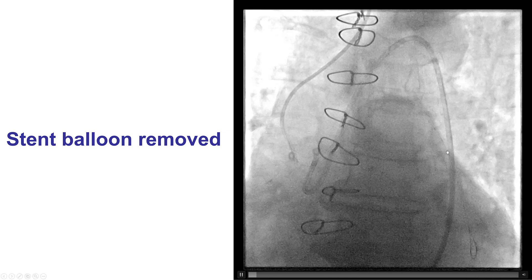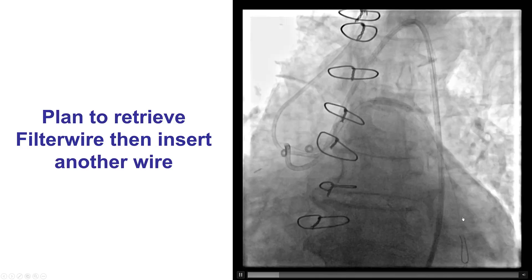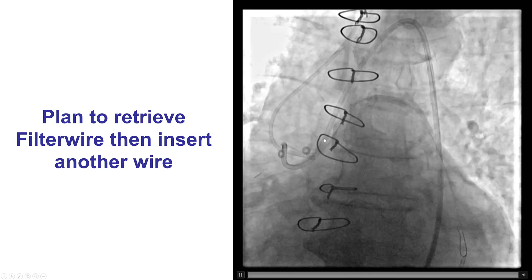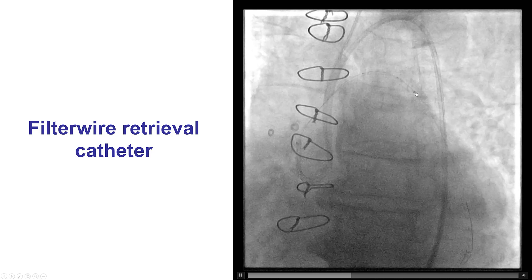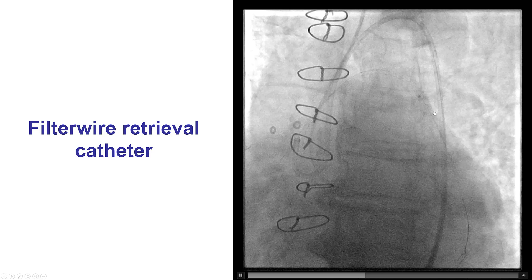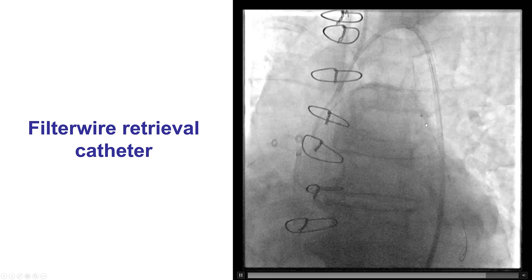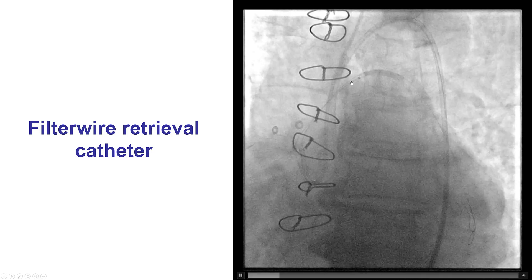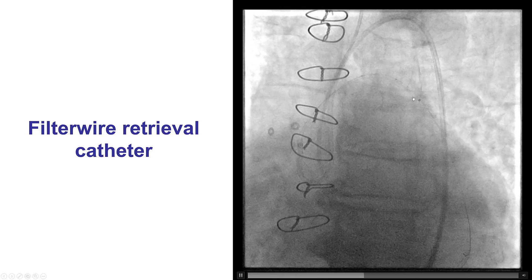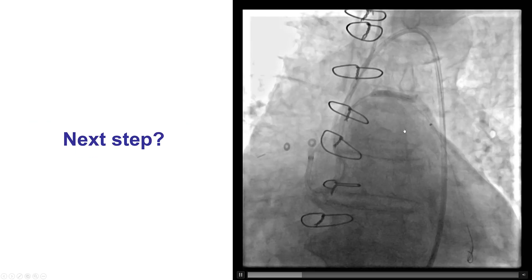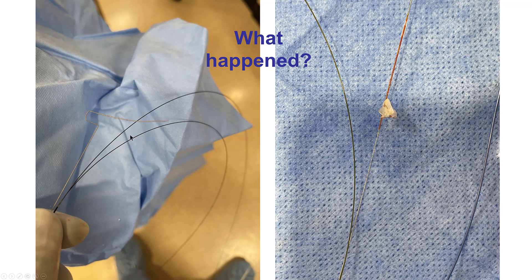Note that the embolic protection device and the new wire appeared to be going straight into the filter — something that would become important later. After inserting another balloon through the new guidewire, we inflated it, continuing to seal the perforation and prevent bleeding into the mediastinum. Our plan was to first remove the filter wire using the filter wire retrieval catheter; unfortunately, we had significant difficulty advancing it through the previously placed stent. In cases like this, a bent-tip retrieval catheter can be used. Instead, we decided — since the vessel was large — to just pull the filter through, although this carries the risk of filter entrapment within the previously placed stent. Unfortunately, the antegrade wire from the femoral guide and the filter wire became intertwined, and it took a lot of force to finally remove them. When removed, both wires were fairly damaged.